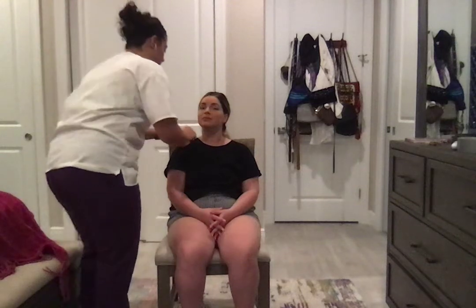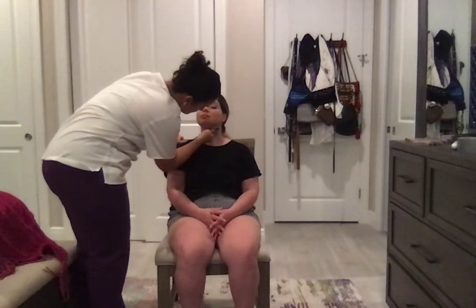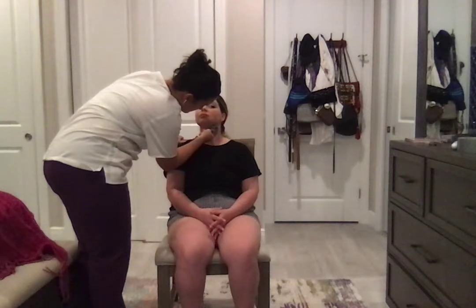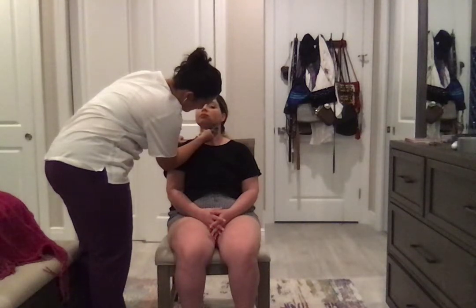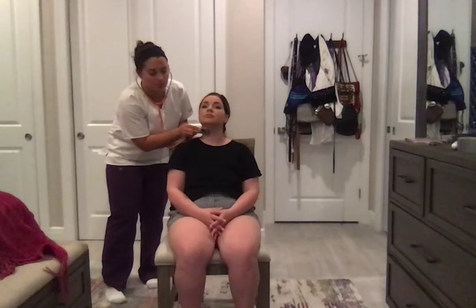Okay, and now I'm gonna auscultate and listen to your carotid artery with both the bell and the diaphragm. Good.